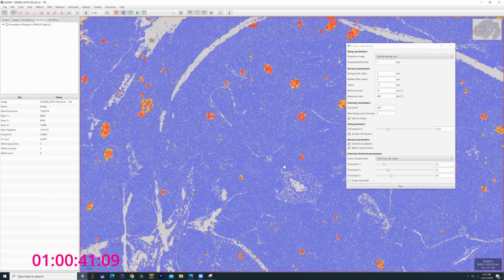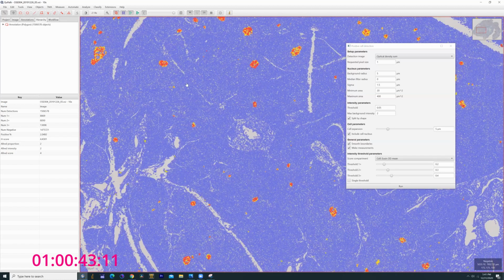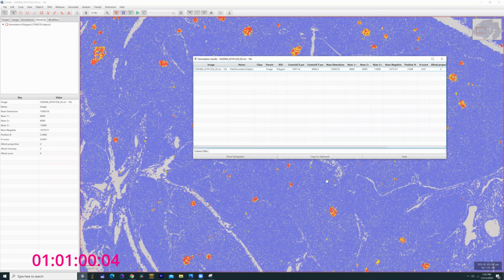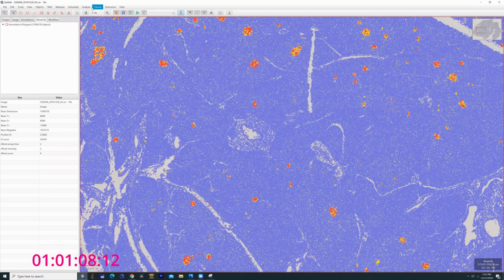So, last little bit here. If you go under TMA information, you can do annotation, which is basically this output. It's useful for, say, copying the files into Excel. You can do a clipboard and copy, and there are your ROIs, your category numbers, your percentages. You can go to analyze.